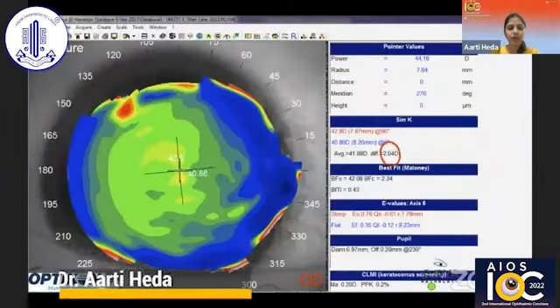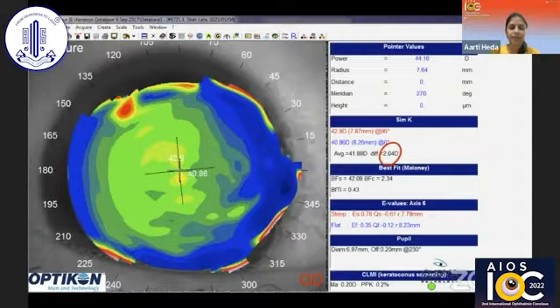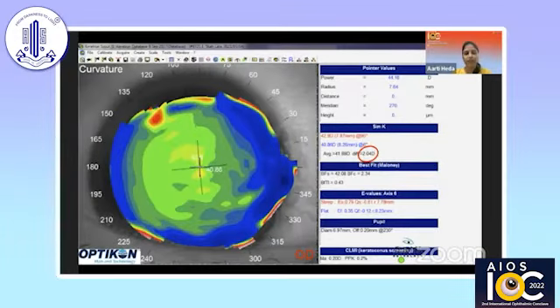Let me show you another case with pre-existing astigmatism of 2 diopters, who happened to be a relative of an optometrist and wanted to get implanted with the Autofocus Pro lens, which is a multifocal lens without any rings. Presently they don't have any toric range of lenses. The other eye also had astigmatism of 2 diopters, and phacoemulsification was done elsewhere. The patient had the same astigmatism of 2 diopters postoperatively. So we decided to do CICS for this eye with the aim of reducing the pre-existing astigmatism of 2 diopters.